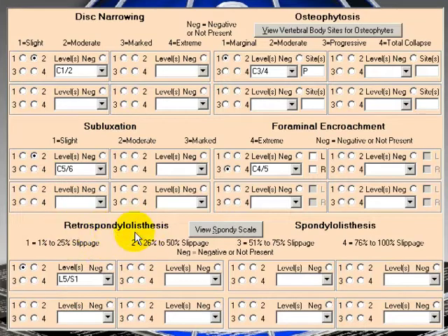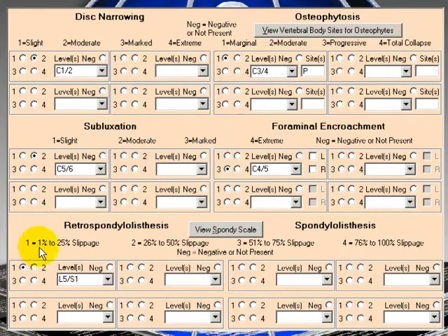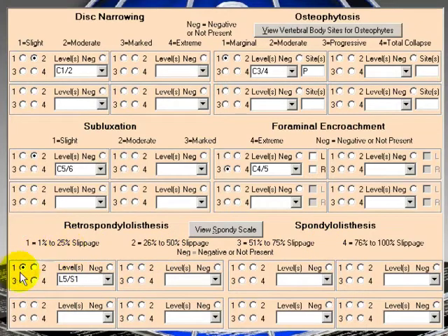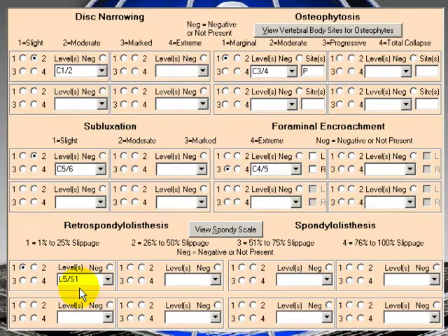For retrospondylolisthesis here, again, our scale here, 1 is 1 to 25% slippage, 2 is 26 to 50, etc. So now we have a 1 to 25% slippage at L5 to S1.